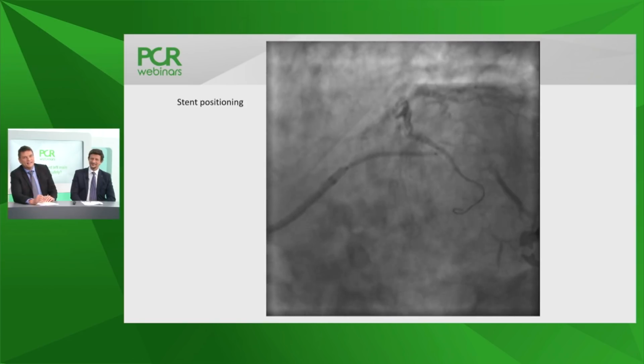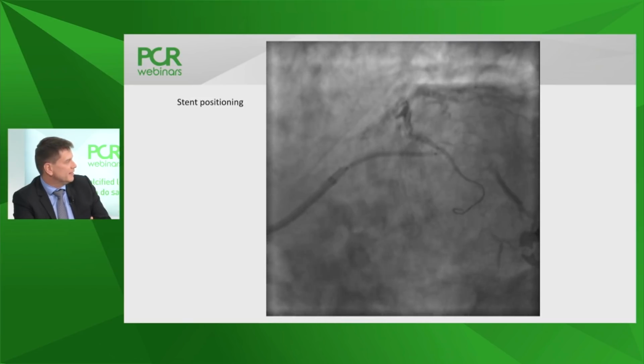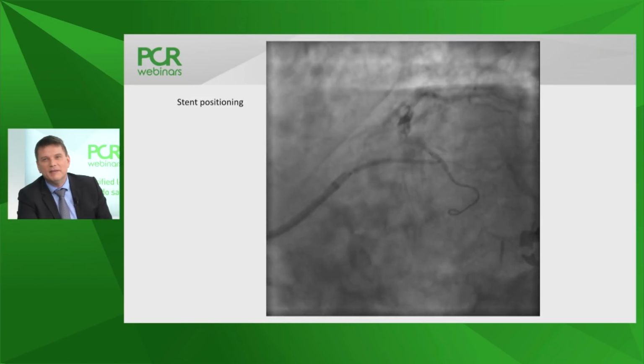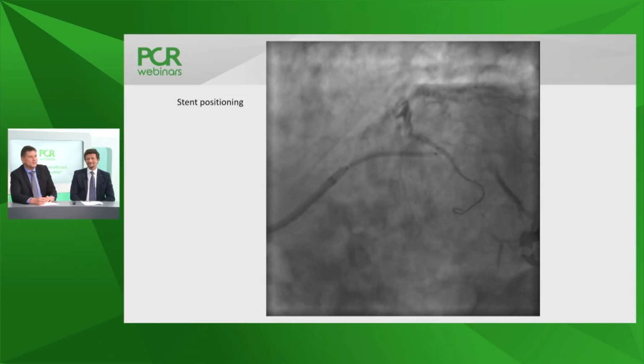And I think this makes a lot of sense for me, because the modern stents are very variable with size. So I might have chosen maybe even only a 3.5 and then would have upsized with balloons afterwards. Well, I want to quickly go back to Flavio.